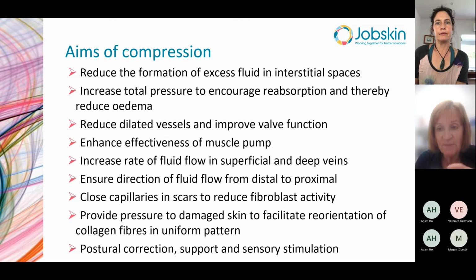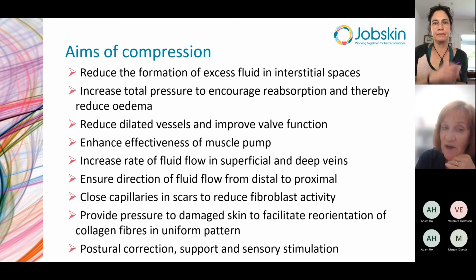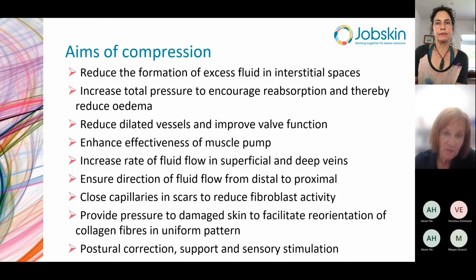The aims of compression specifically include reducing the formation of excess fluid in interstitial spaces, increasing the total pressure to encourage reabsorption and thereby reduce edema, reducing dilated vessels, particularly veins, and improving valve function, enhancing the effectiveness of the muscle pump, increasing the rate of fluid flow in superficial and deep veins, ensuring the direction of that flow is from distal to proximal, closing the capillaries in scars to reduce fibroblast activity, providing pressure to damaged skin to facilitate the reorientation of collagen fibers in a uniform pattern in the case of hypertrophic and keloid scarring, and to correct posture, provide support, and provide sensory stimulation.